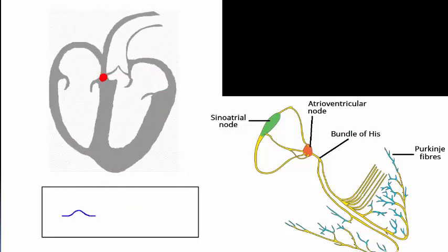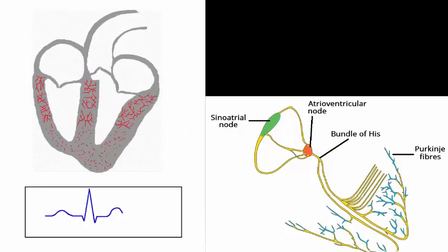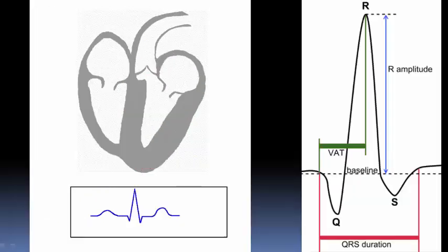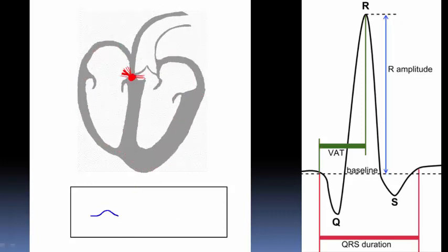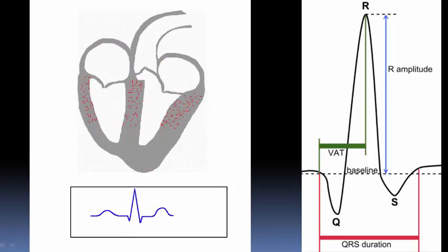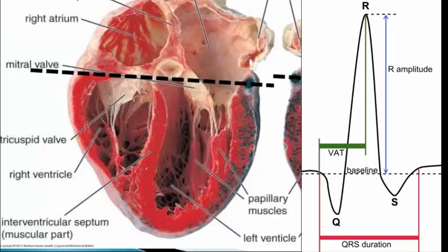Once the depolarization wave crosses the AV node, the bundle of His, bundle branches and Purkinje system are then activated, initiating ventricular myocardial depolarization. The wave of depolarization of the ventricles can be recorded in the ECG in the form of QRS complexes. The part of the heart that has maximum muscle will produce the highest voltage on ECG. We all know from our previous knowledge that the muscle mass of the left ventricle is much larger than that of the atria and even the right ventricle, so the QRS complex is much larger than the P wave.